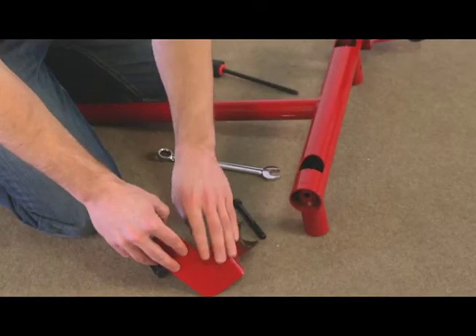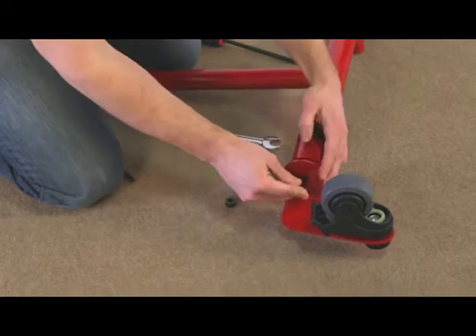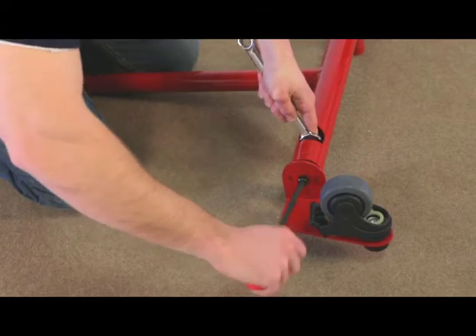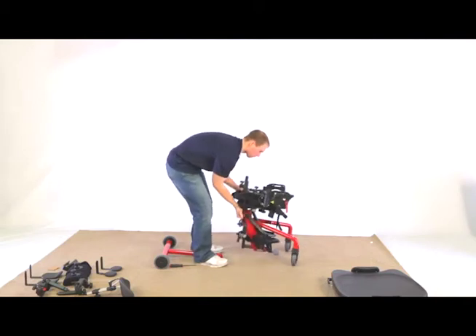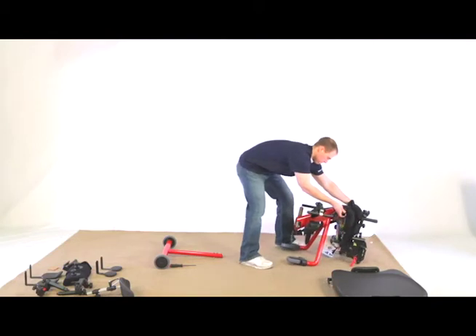If the front swivel casters for the swing-away front were ordered, attach the caster assembly to the axle as shown. Line up the bolt and nut using a 17mm wrench and hex wrench. Tighten the nut securely. If the back of the unit is folded onto the seat, secure the back with one hand and position the base of the unit as shown to install the front wheel assembly.